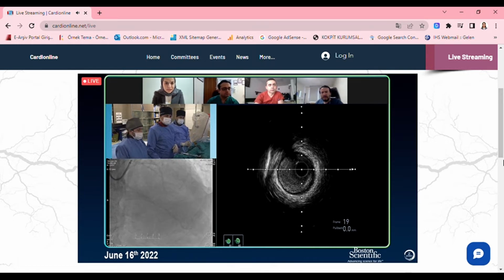All right, and I can see with this eccentric calcification, atherectomy is definitely a great approach here, as opposed to other modalities, NC balloons and IVL. Okay. You can go ahead and let us know where you're at now.